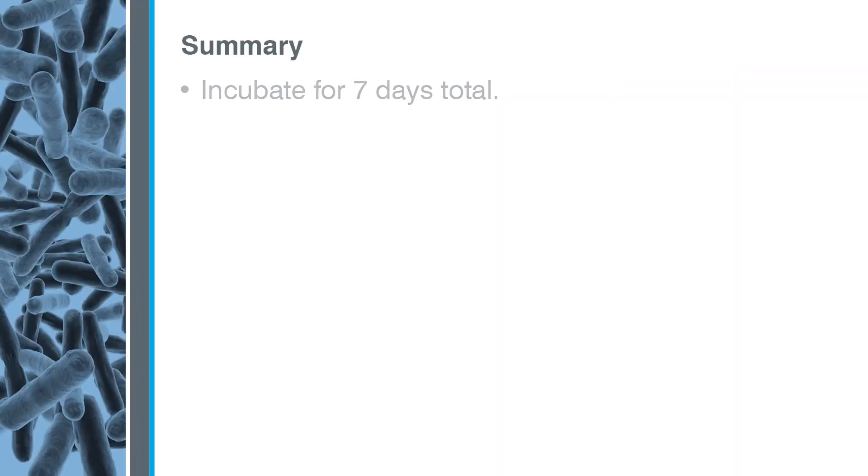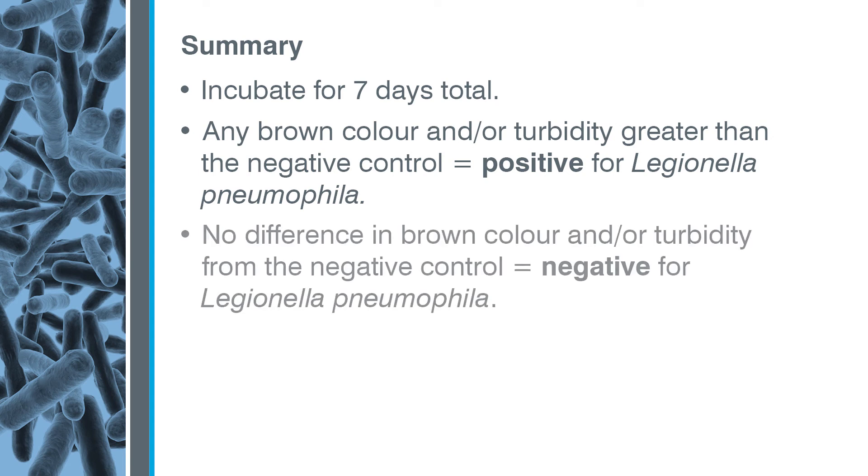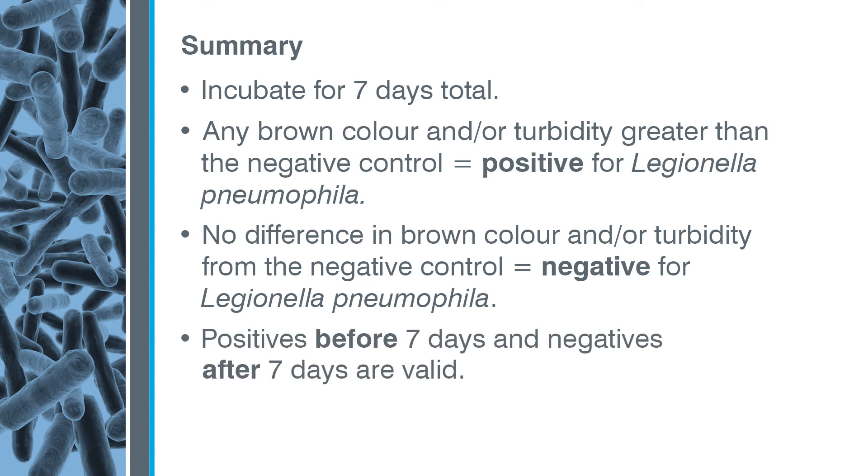Remember, incubate samples for seven days total. Samples with any brown colour and/or turbidity greater than the negative control are positive for Legionella pneumophila. Samples with no difference in brown colour and/or turbidity from the negative control are negative for Legionella pneumophila. Positives before seven days and negatives after seven days are also valid. Always follow these testing guidelines. Use only sterile diluents. Refer to the product insert for details.